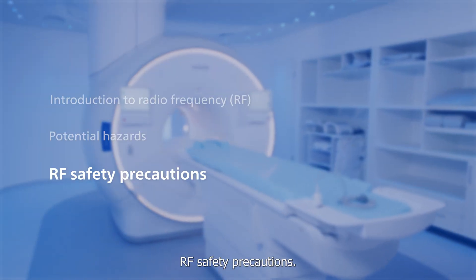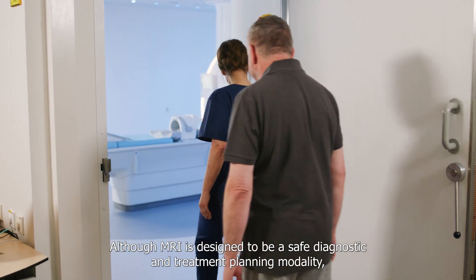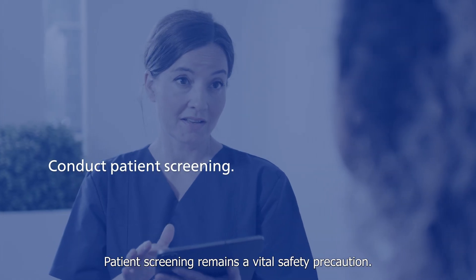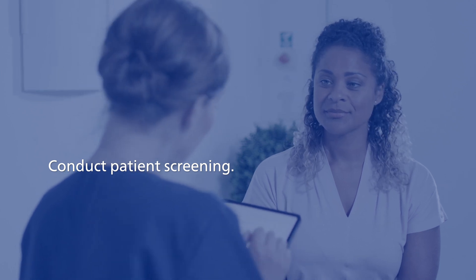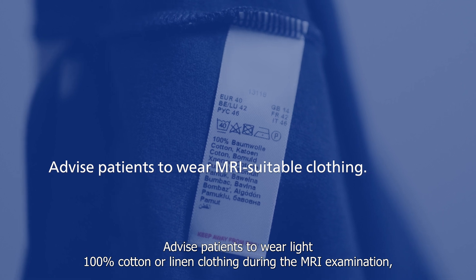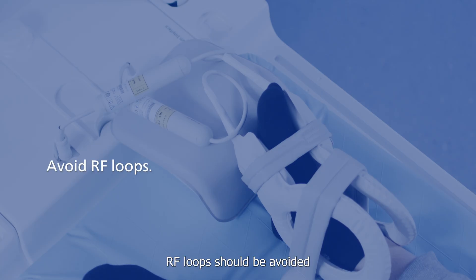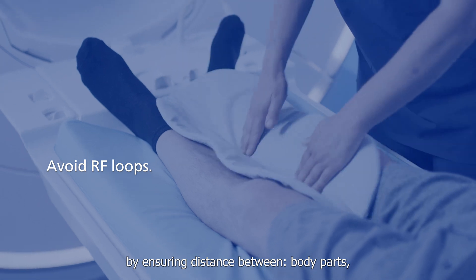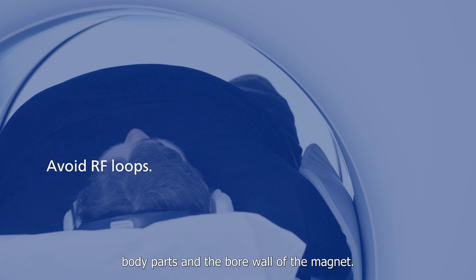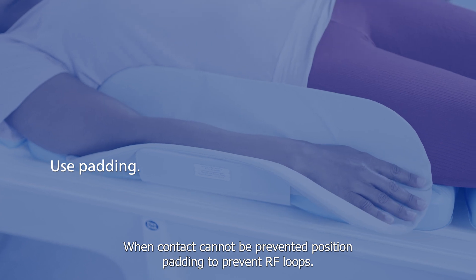RF safety precautions. Although MRI is designed to be a safe diagnostic and treatment planning modality, there are some potential hazards for which precautions must be taken. Patient screening remains a vital safety precaution. Advise patients to wear light 100% cotton or linen clothing during the MRI examination, or provide suitable garments. RF loops should be avoided by ensuring distance between body parts, body parts and coil cables, and body parts and the bore wall. When contact cannot be prevented, position padding to prevent RF loops.